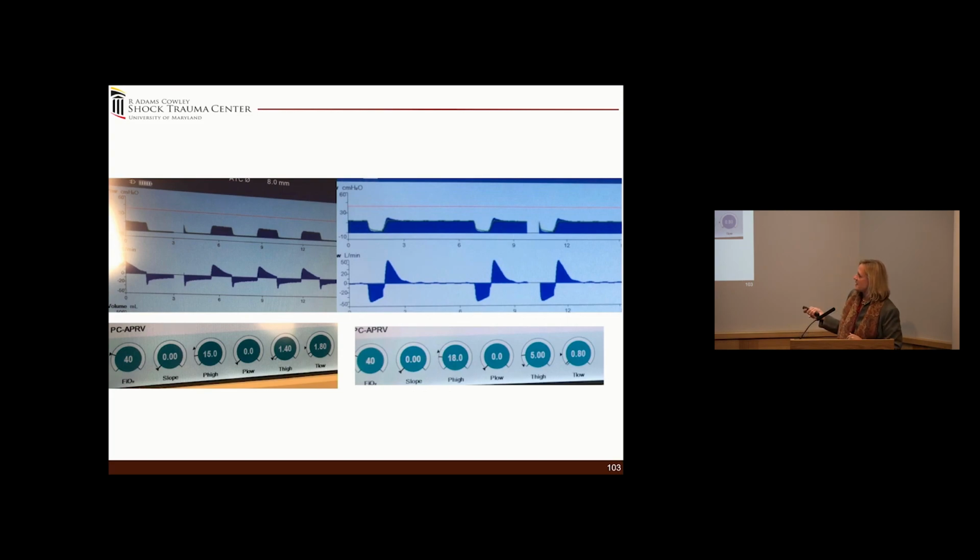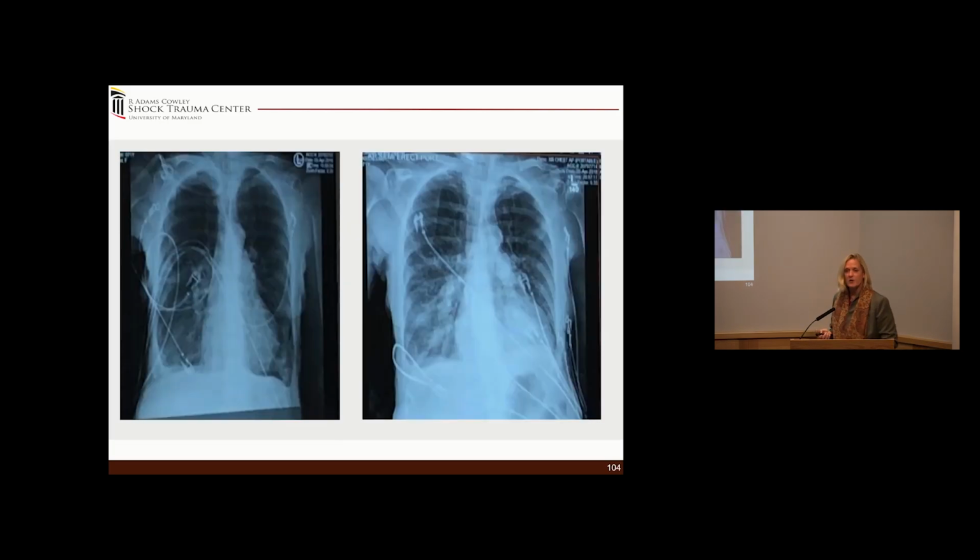Now what's interesting is almost 2 seconds. Do you see hardly any change here? Right? I mean, it's still at 50%, so we can still go out even further. Can you believe that this is the same patient? Can an obstructive patient become restrictive? Yeah, you can lose lung volume, right? So this is the real COPD patient with those settings.